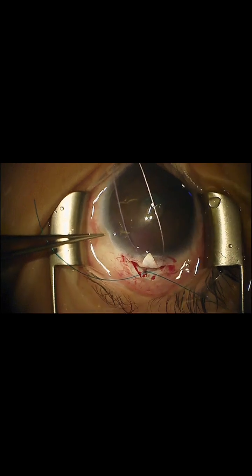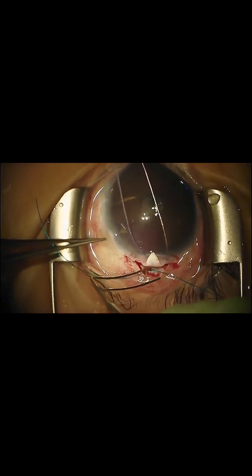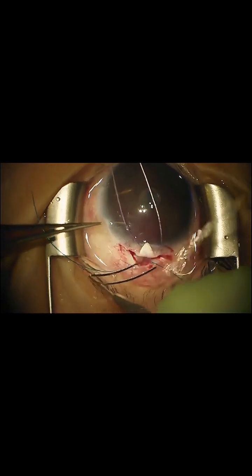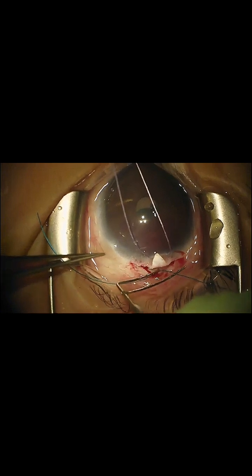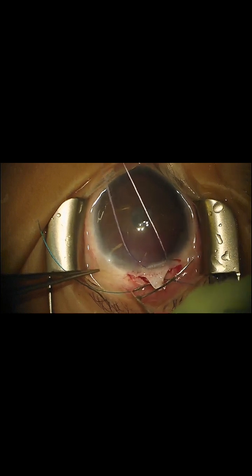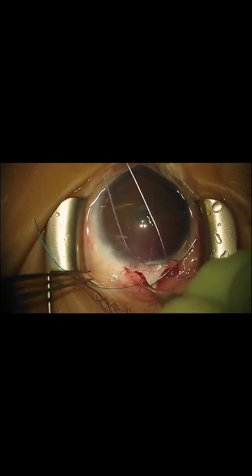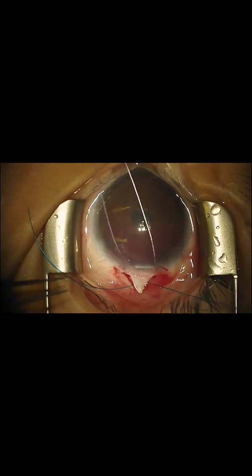And I didn't rotate it 90 degrees because I didn't want my chamber to collapse yet. Going to the other direction now. And now I'll go past 90 degrees this time, okay?